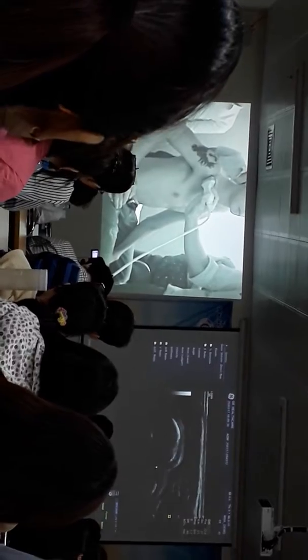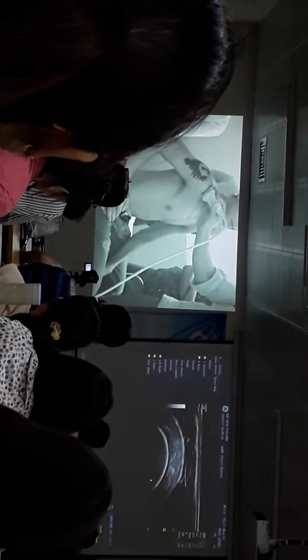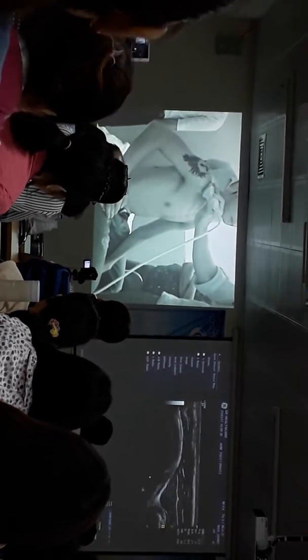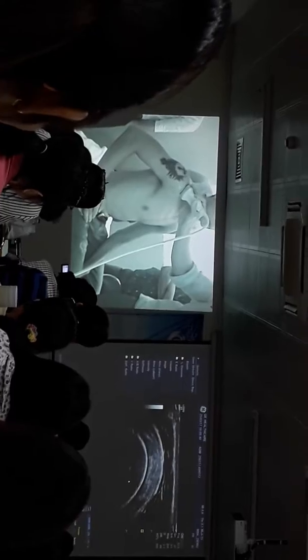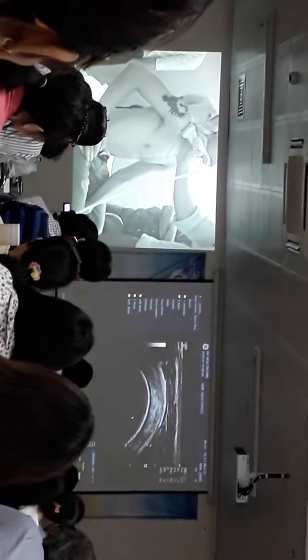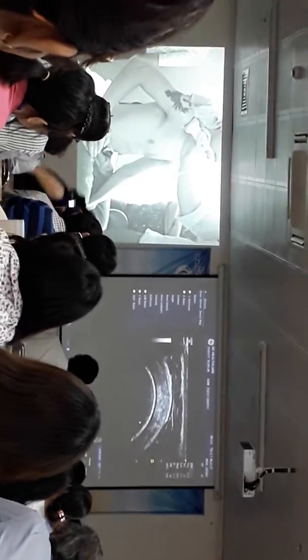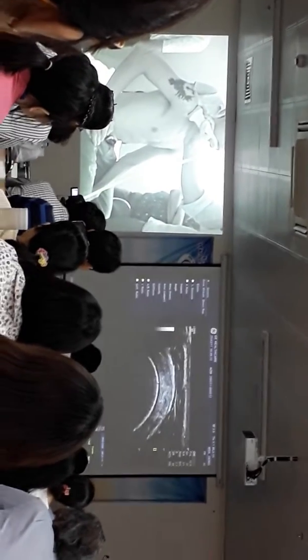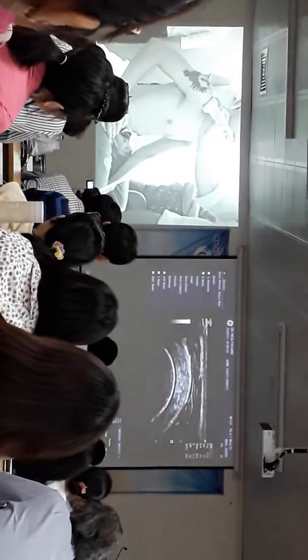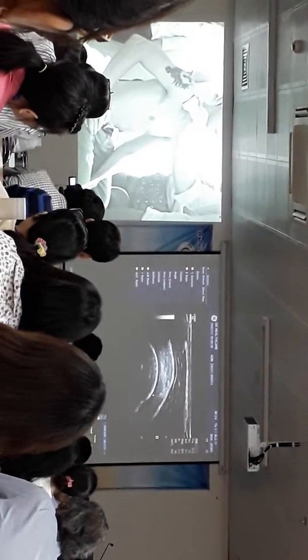So once again, it's important to move all the way through the tendon just by using a fanning motion. So we need to rock the probe just to make sure that we're filling in all of those little hypoechoic areas, and to exclude anisotropy. And once again, we can see that hypoechoic line, which is the articular cartilage, very nicely there.